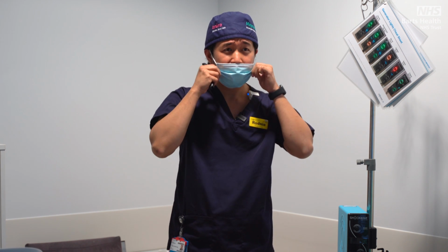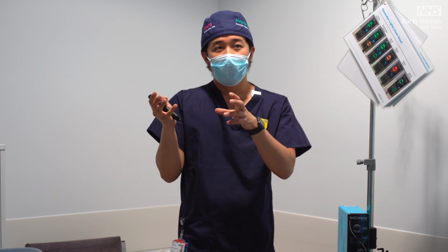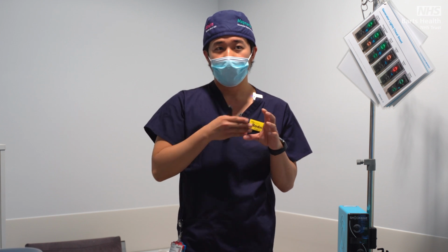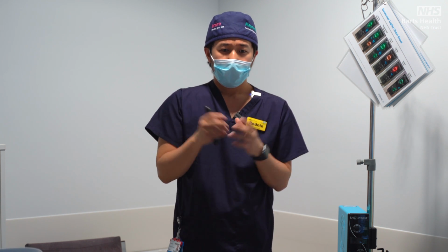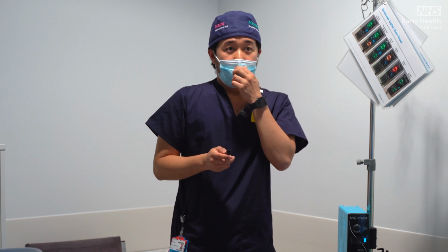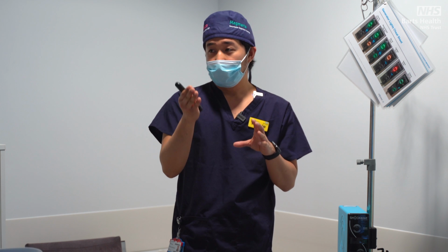Normally our artery is very elastic. You can expand it, you can bend it, but the problem is if there's calcium in one of the layers, it inhibits the expansion, especially if you deploy a stent. This calcium is situated actually between the layers.